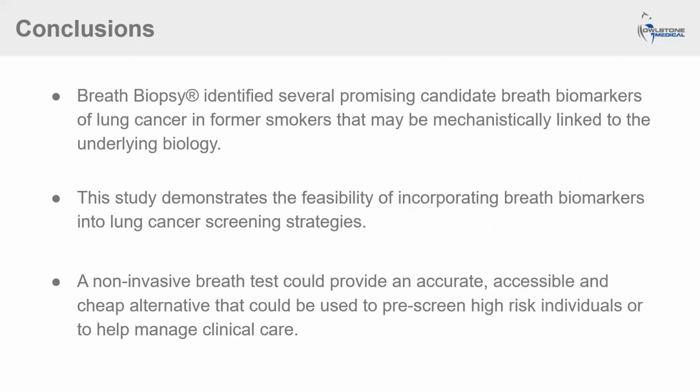In conclusion, applying non-targeted profiling of breath VOCs to a population of former smokers identified several promising candidate biomarkers for lung cancer. The identity of these markers suggests that they are mechanistically linked to underlying oxidative stress and lipid peroxidation associated with enhanced metabolism of proliferating tumor cells. Of course, as with any study, these findings need to be validated.